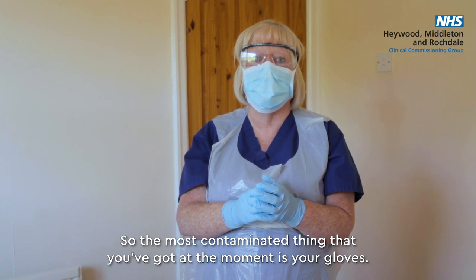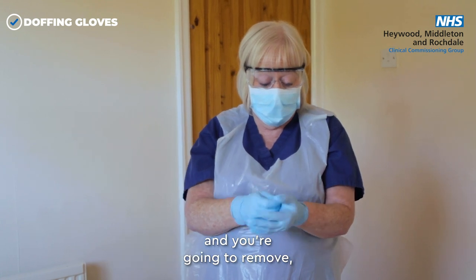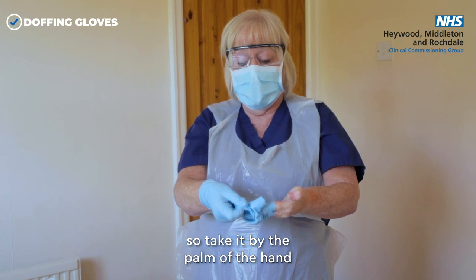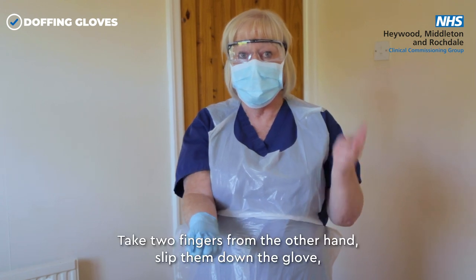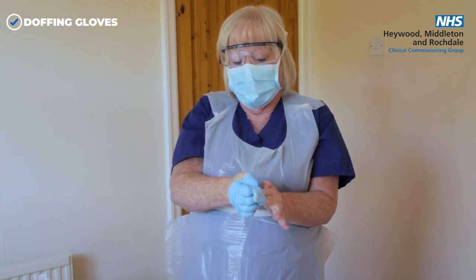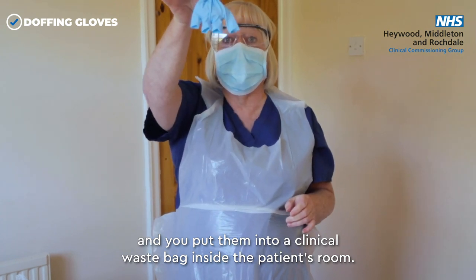The most contaminated thing you have at the moment is your gloves. Take your dominant hand and remove the other glove — take it by the palm of the hand and pull it off, then grab it with the other hand. Take two fingers from the other hand, slip them down inside the glove, pull it off so the first glove is contained inside, and put them into a clinical waste bag inside the patient's room.